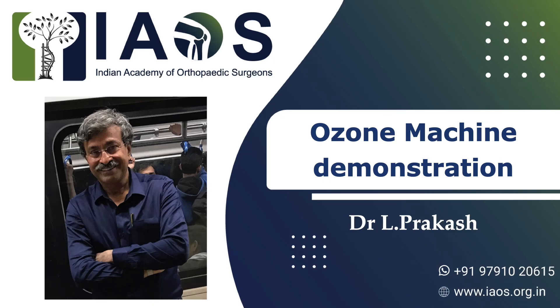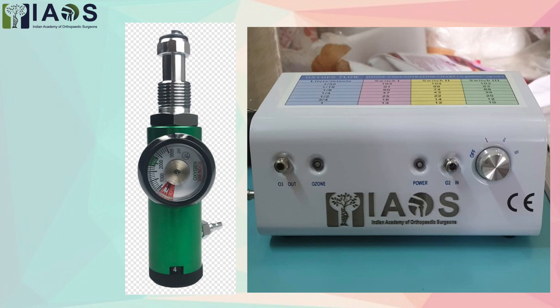Friends, Indian Academy of Orthopedic Surgeons is proud to present an ozone machine for the use of orthopedic surgeons, pain management surgeons, rheumatologists, and allied practitioners.